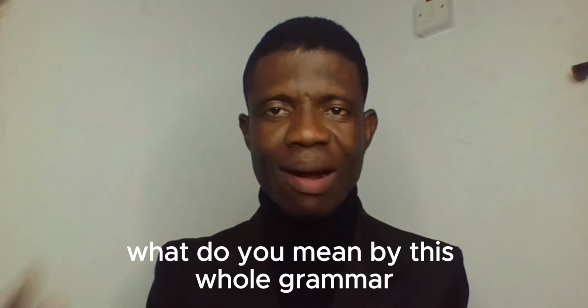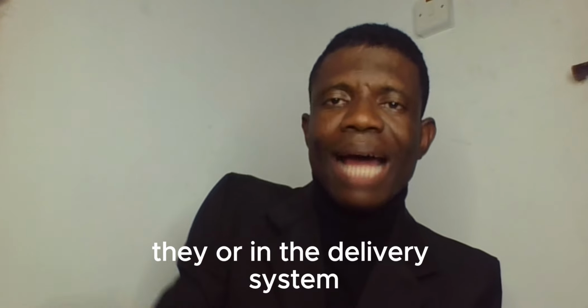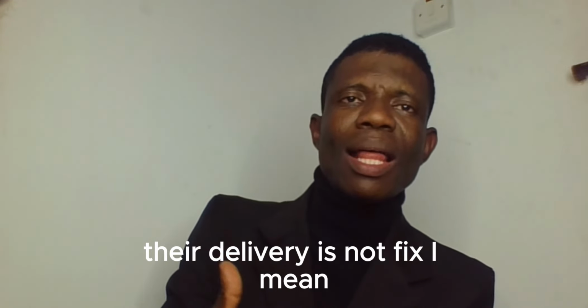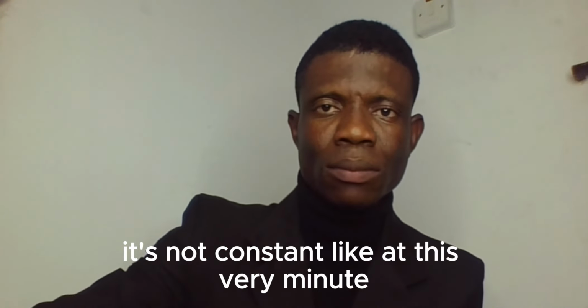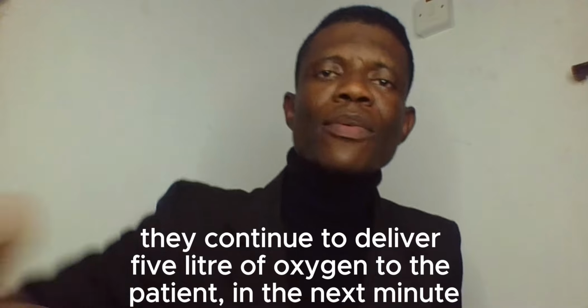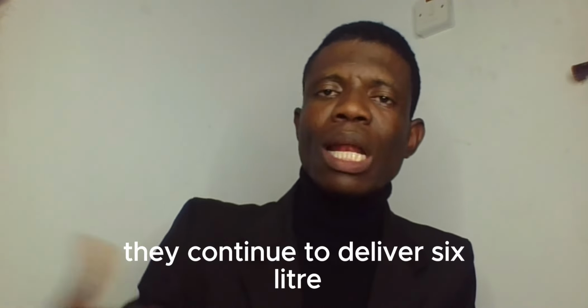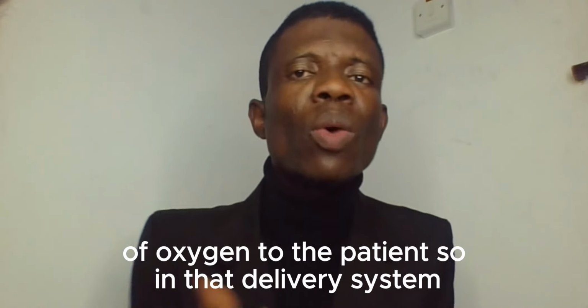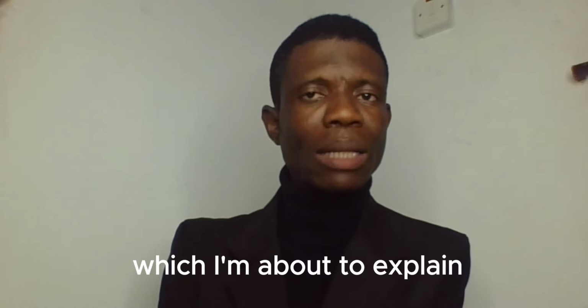What do I mean by this whole grammar? It means that in the delivery system of these medical devices, their delivery is not fixed. I mean, it's not constant. Like at this very minute, they can choose to deliver 4 liters per minute to the patient. At the next minute, they can choose to deliver 5 liters of oxygen to the patient. In the next minute, they can choose to deliver 6 liters of oxygen. So in their delivery system, they are not rigid, unlike the other one, which I'm about to explain.